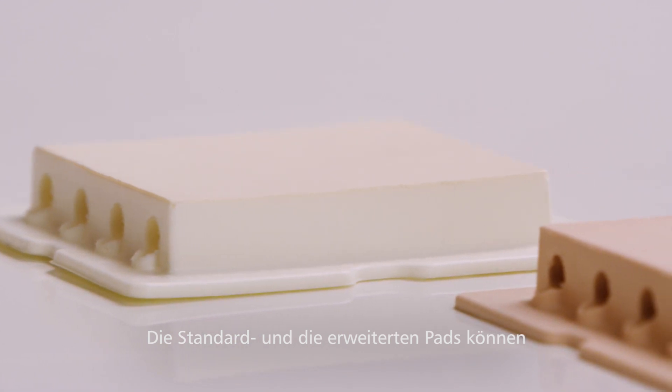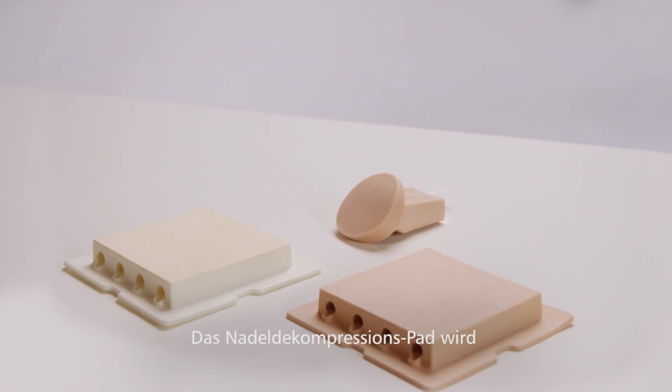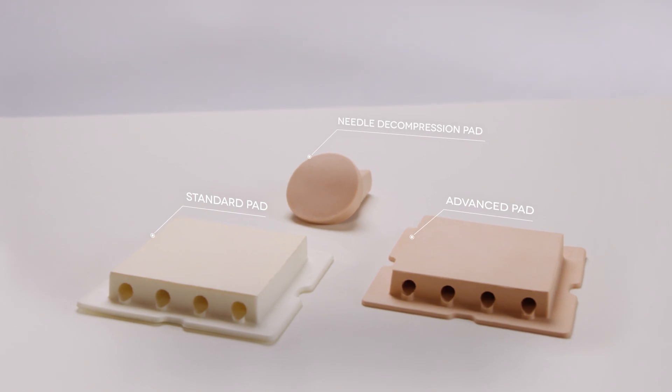The trainer can be used with the standard or advanced pads for chest tube insertion and chest drain. The needle decompression pads can be used to convert a tension pneumothorax into a simple pneumothorax.